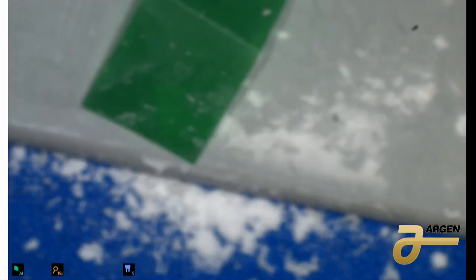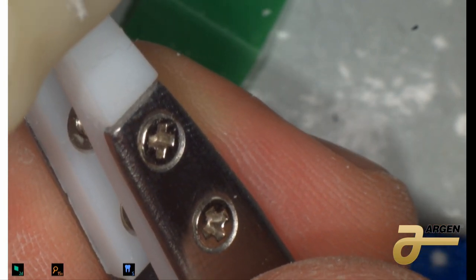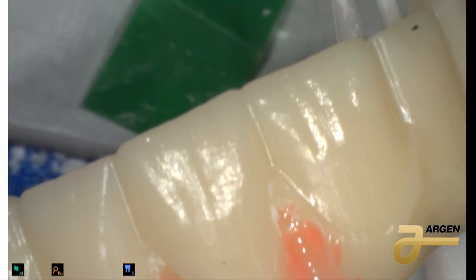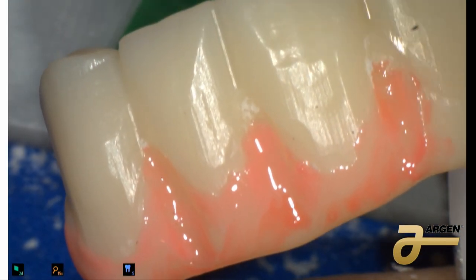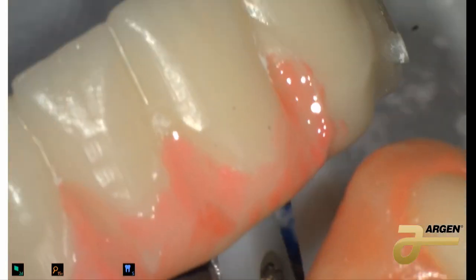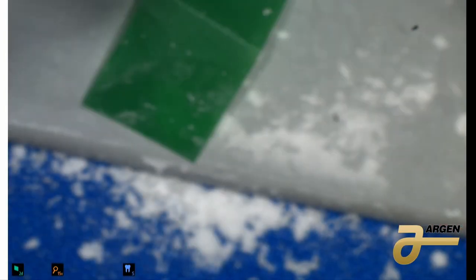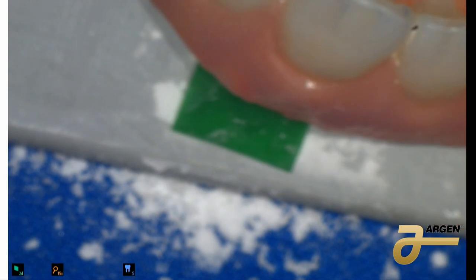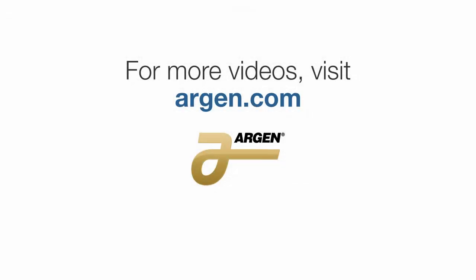There is beautiful material in the market now to do this. The reason I use these two materials is because I want to get as close as possible to my final restoration — both arches as close as possible. Mixing the cream with the red, I can have the same effect we had before. The first layer is the stain, and you put more salmon to get that color. This is the way we do it — ceramic and composite, using the same colors for everything. Be careful with the silver problem. Thank you.